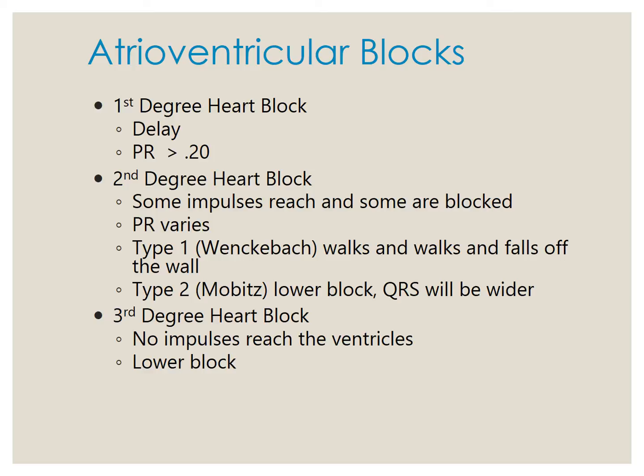And again, please, you'll go into more detail. I can show you in class, but that's not something you're going to need as far as the content of this course and this exam at this point. We're going to be going over the first degree, which I just told you about, and then third degree. Third degree AV block, none of the impulses reach the ventricles, so it completely blocks the conduction of the atrial stimuli to the ventricles. So there's going to be no rhyme or reason when you're looking at these, and I will show you strips that have these.